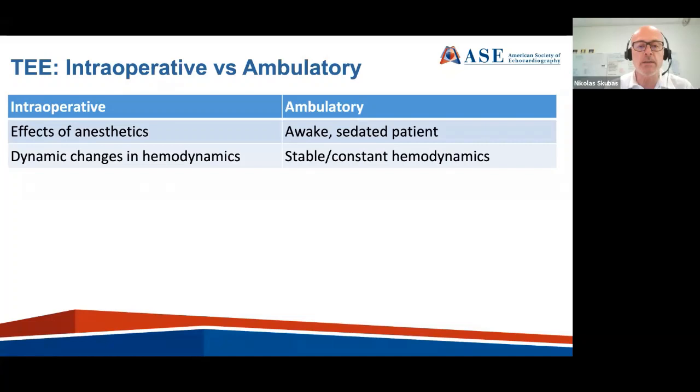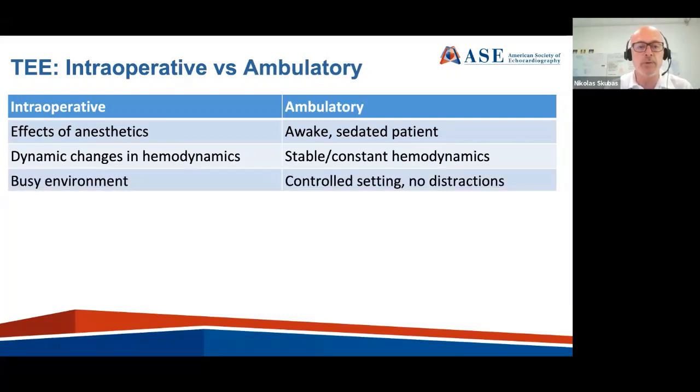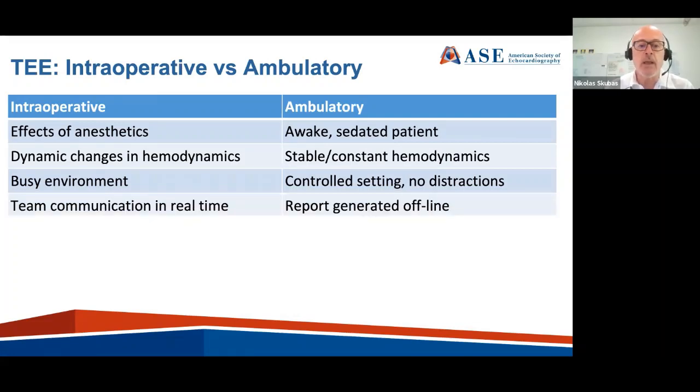So hemodynamics change, and sometimes do change in a very dynamic fashion, because while the exam is underway, you may have interference from the surgeon with electrocautery, manipulation of cardiac structures in the body of the patient from outside. It is not a quiet place. It is not similar to the lab, where there's only the operator, the assistant, and the patient. The patient is asleep, but there are teams of people working around. The light is very bright, there may be noise, and the physical space actually may be very limited. So easily somebody may get distracted while trying to go down the path of a comprehensive TEE exam.